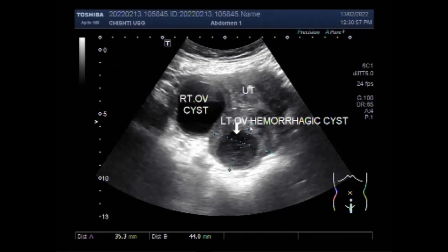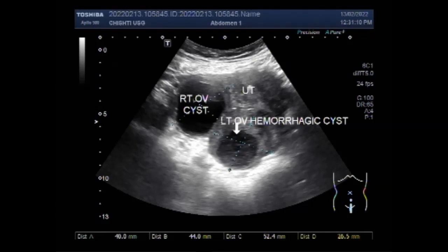Now you can see the hemorrhagic ovarian cyst, and it measures about 4.4 cm x 4.0 cm. The simple cyst measures about 5.2 cm x 4.5 cm.